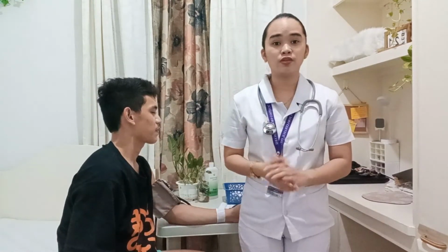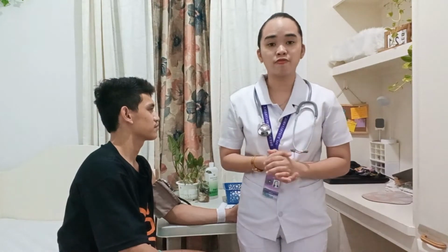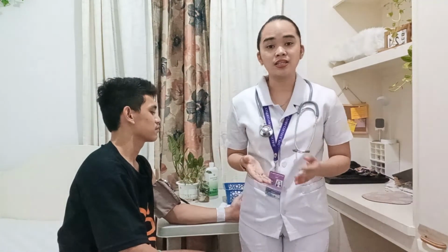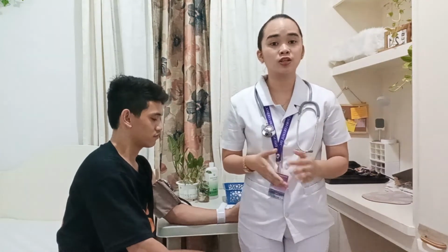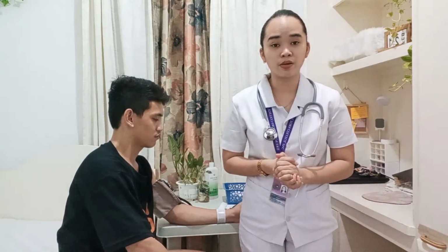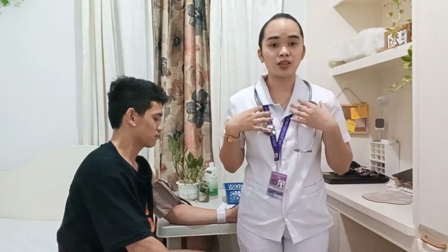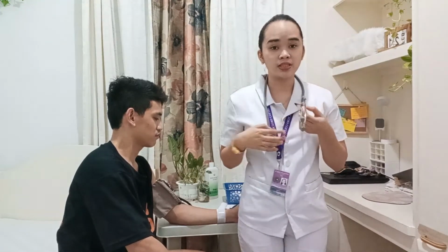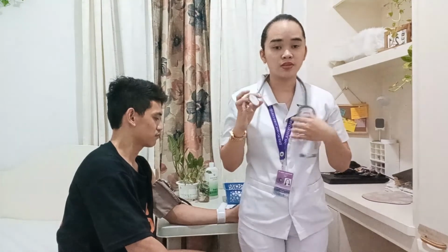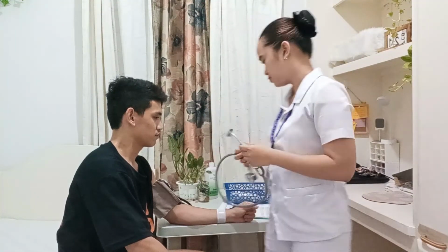For the actual taking of the blood pressure, I'm going to inflate the cuff to about 30 millimeters of mercury higher than the estimated systolic pressure. This will help us avoid missing the auscultatory gap, which is the temporary disappearance of the Korotkoff sounds during the deflation of the cuff. And I'm going to use my stethoscope, but first I'm going to disinfect the earpieces, the bell, and the diaphragm to avoid contaminating our patient.